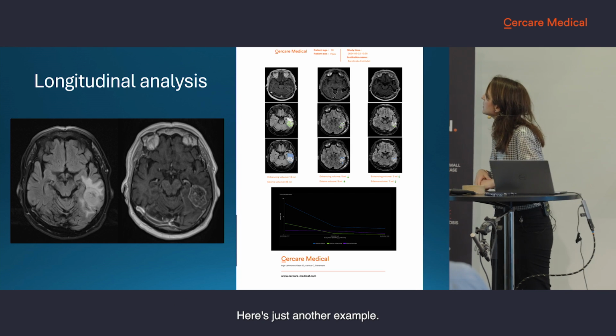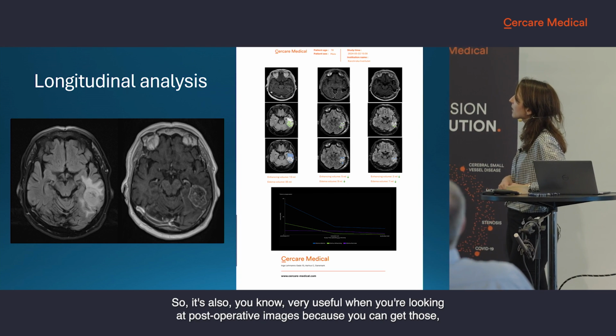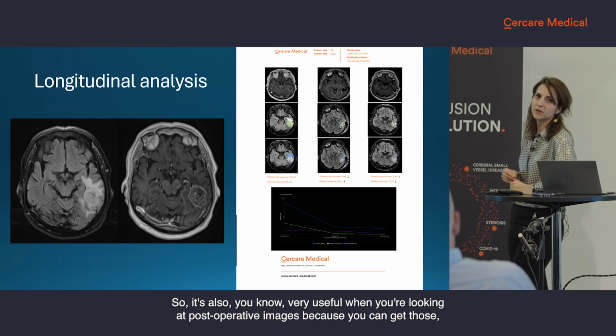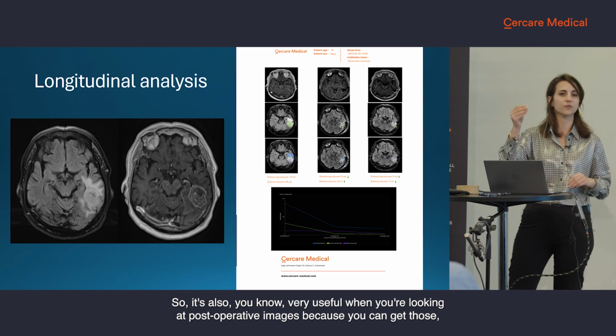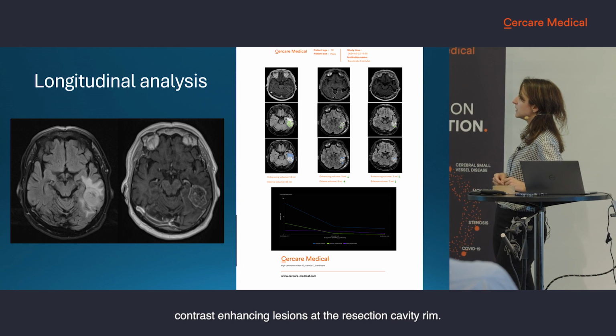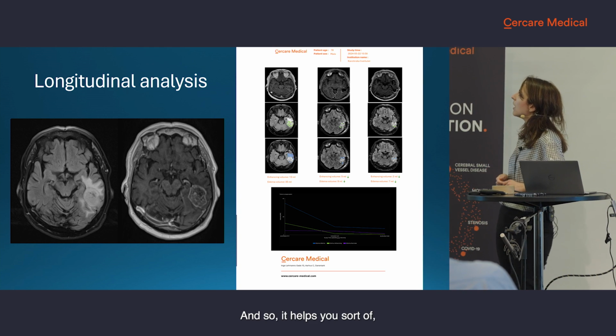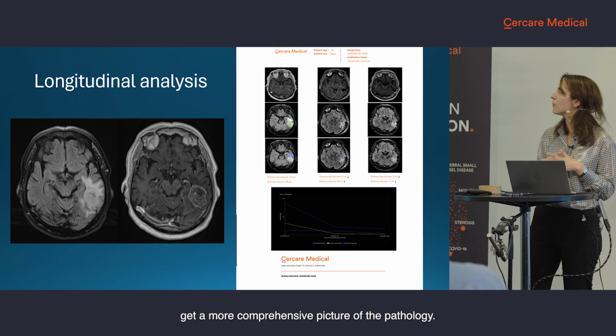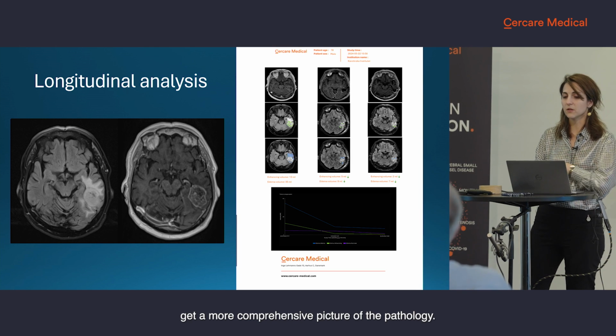Here's just another example. It's also very useful when you're looking at postoperative images because you can get those contrast-enhancing lesions at the resection cavity rim. And so it helps you get a more comprehensive picture of the pathology.